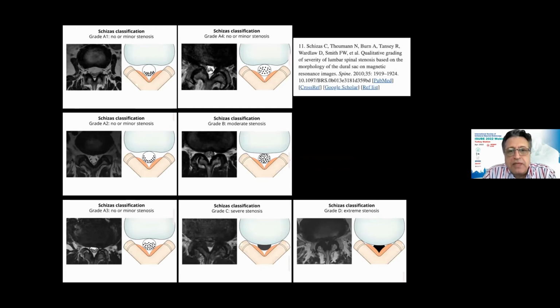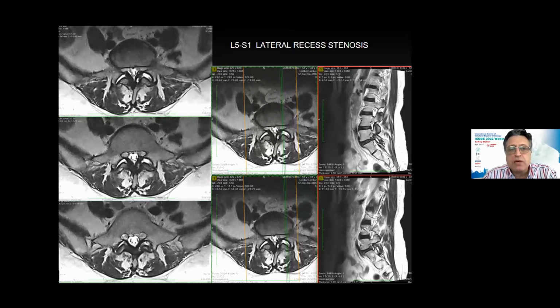Now we know that this is a combined pyramid, and the intervertebral foramen and spinal canal are also multidimensional. So we should not make our calculation only with a sagittal plane, and we should not say, oh, I will resect the tip of the SAP with the transforaminal approach and I will finish the surgery.